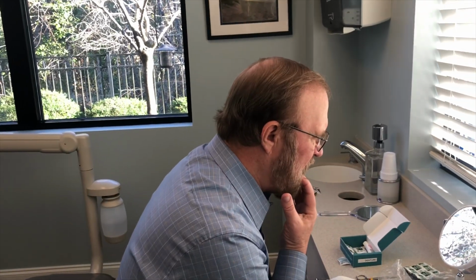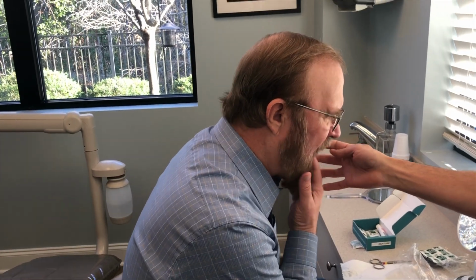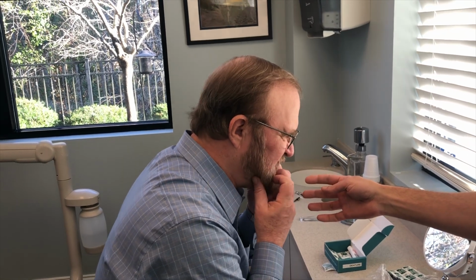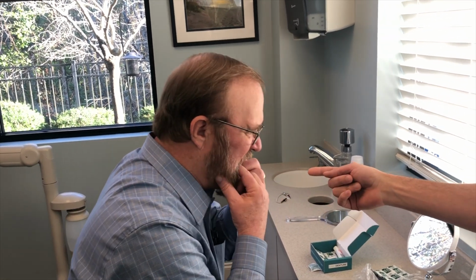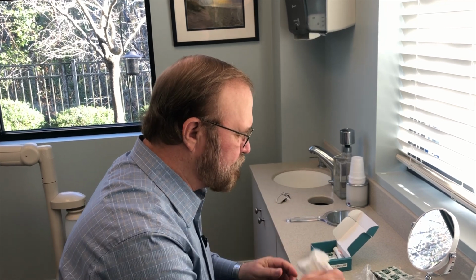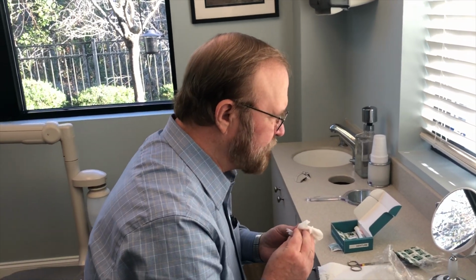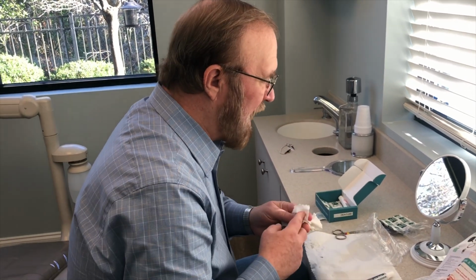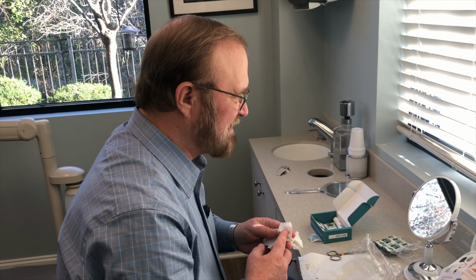What do you mean? So you see in the very back corner here, that back molar isn't touching when you close down. See the back molar right there? Does it feel okay? It feels comfortable too? It does feel all right, though. Okay. Let's take a look here. Was it open really big?